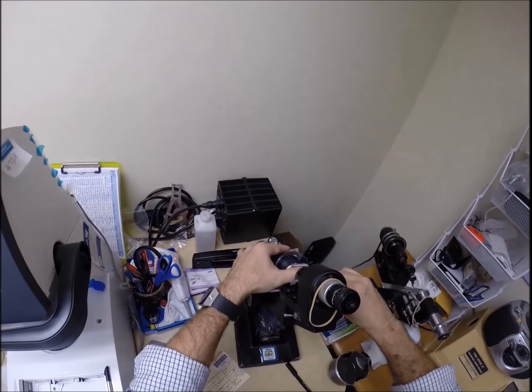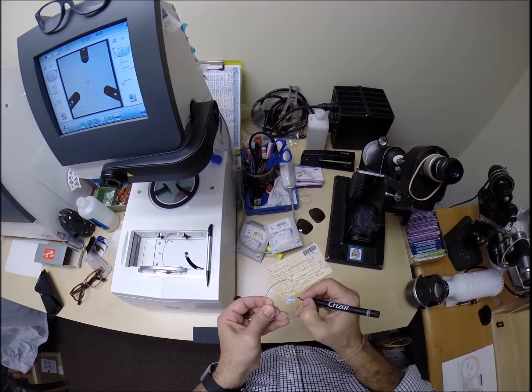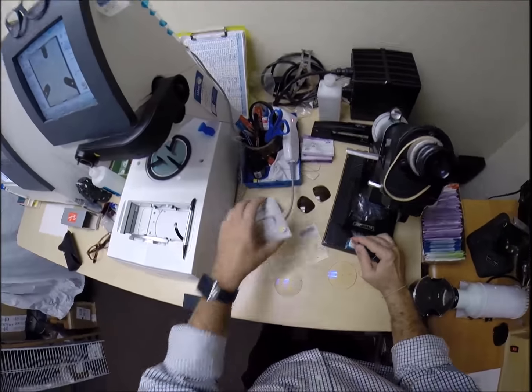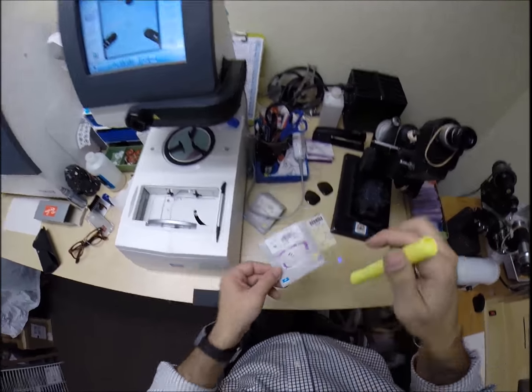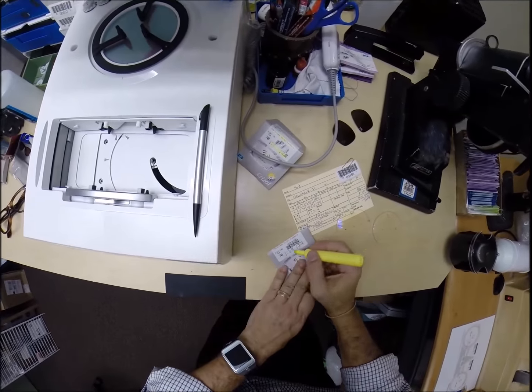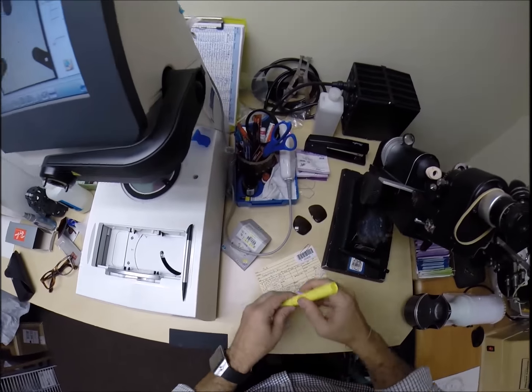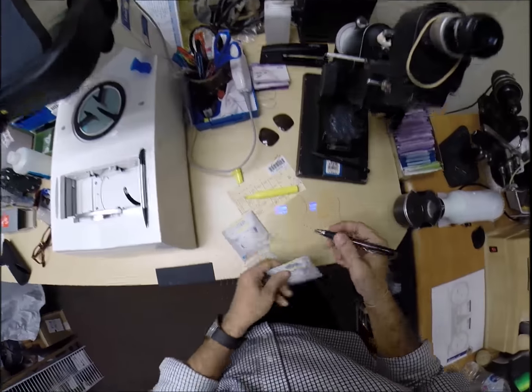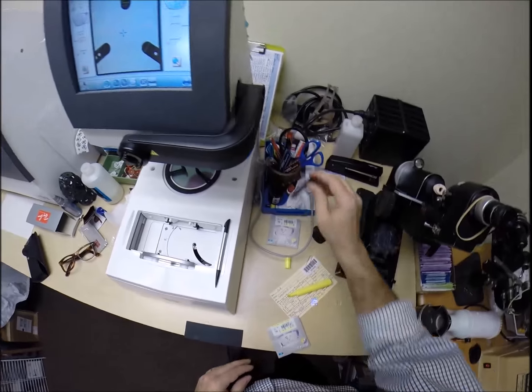And then let's put 3 dots on your lenses. That one was a little bit better. And this is the left lens. Let's go ahead and mark this one. That way you'll know you're getting the authentic Crizal Prevencia lenses. I'm going to highlight this packet so when you get these in the mail, you will see this yellow highlighter. And of course, this is the right lens. This is the left lens.